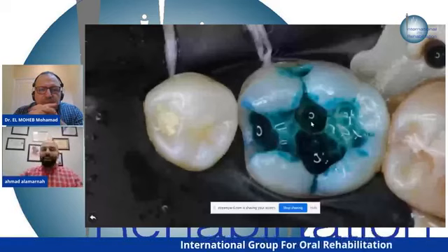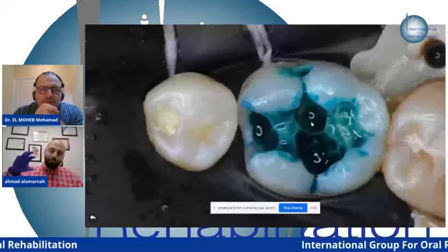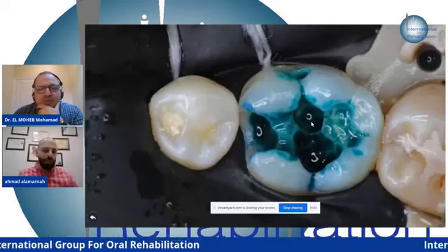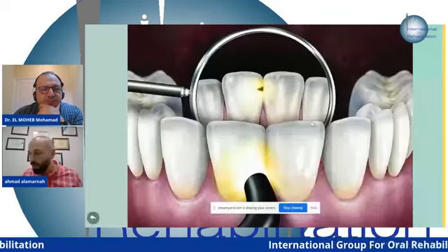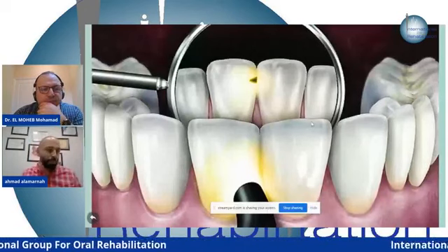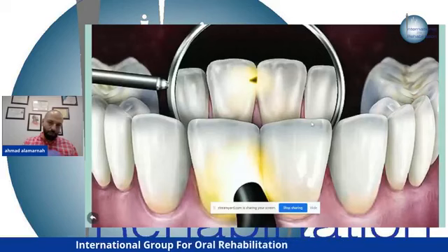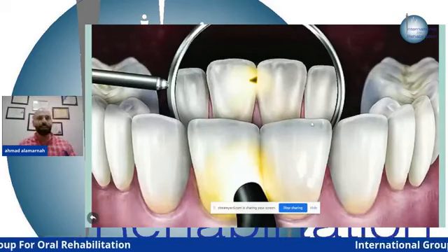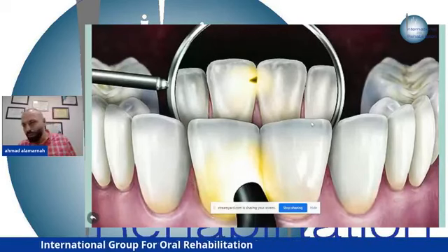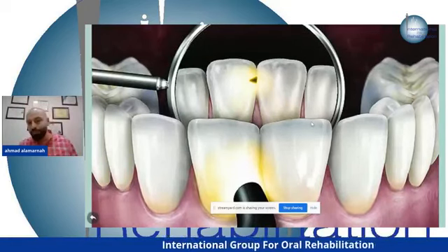A very light stain, you can leave it. But when you have a darker stain, it's caries, and you have to remove it. We have a question here. What about the chlorhexidine instead of sodium hypochlorite? You can use chlorhexidine, but we use chlorhexidine in the next steps. So sodium hypochlorite is more efficient at this stage, because it removes all the bacterial byproducts within the smear layer. So it's very good.